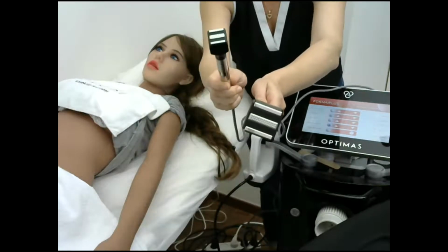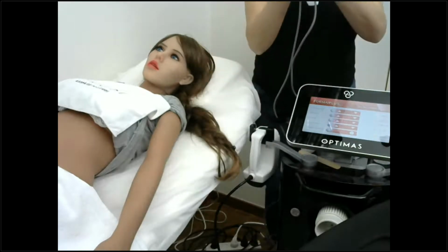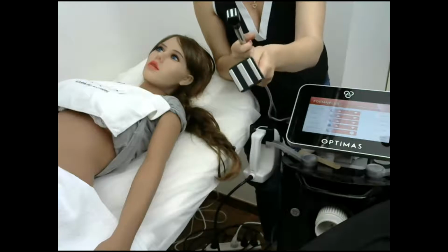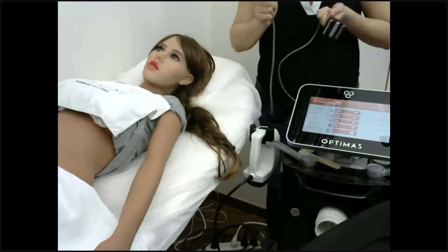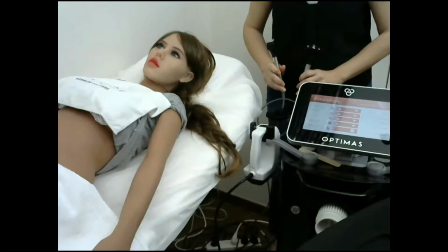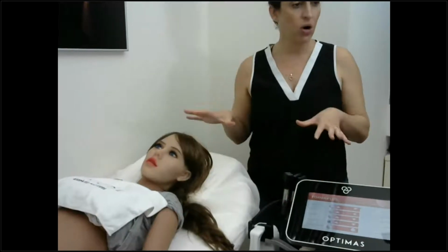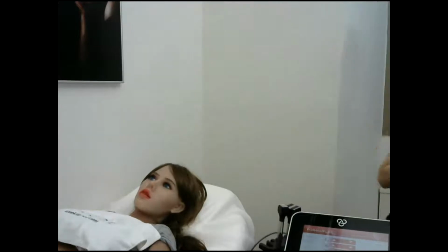Facial treatments, facial and neck treatments, and body treatments. Don't attempt to treat the face with a Plus applicator, because you'll end up hurting your patient and causing some adverse events. Remember, it also has an effect on the depth of penetration. So before actually starting the treatment, what I want to do is clean up my patient's skin.